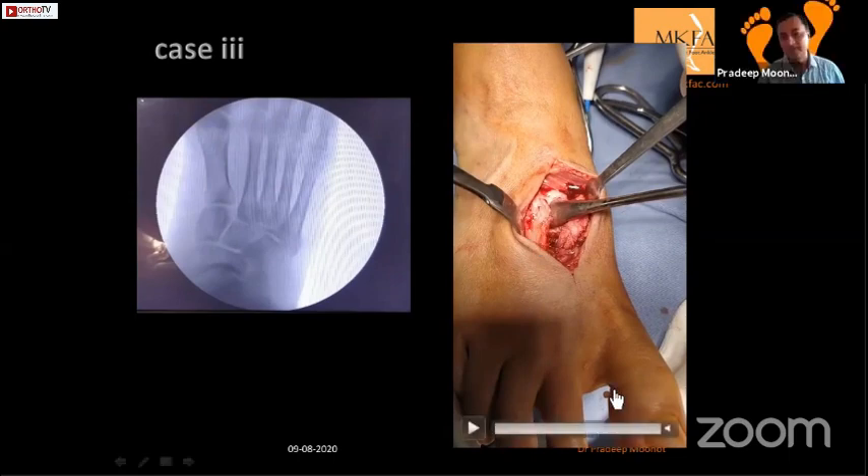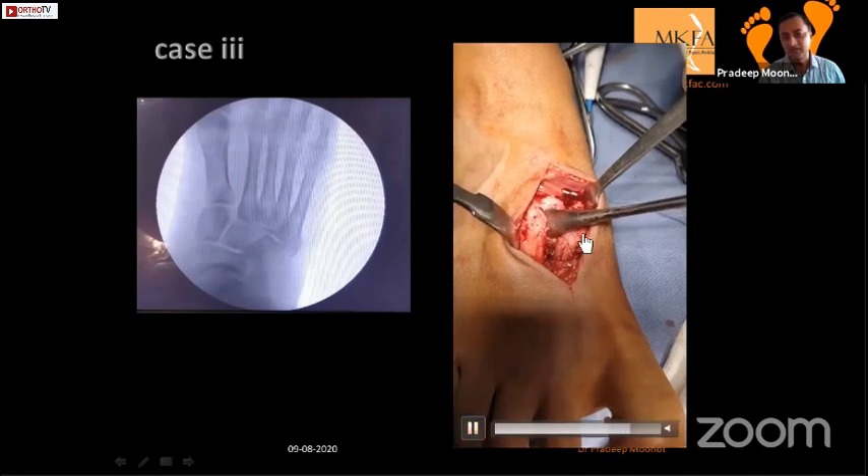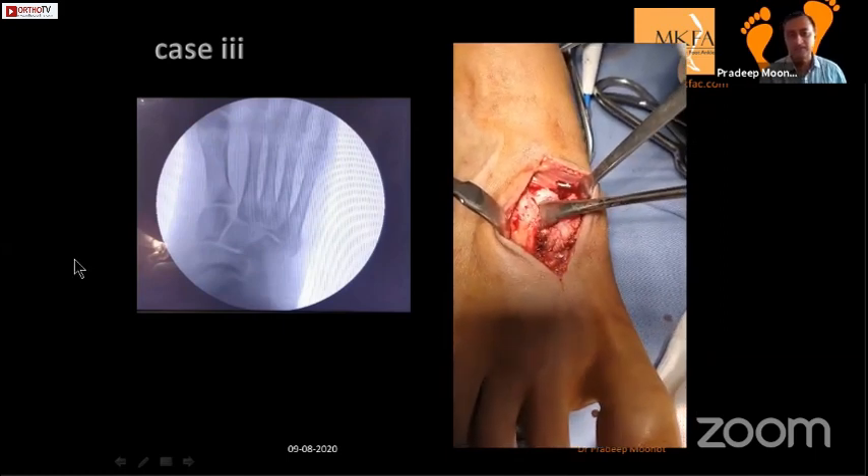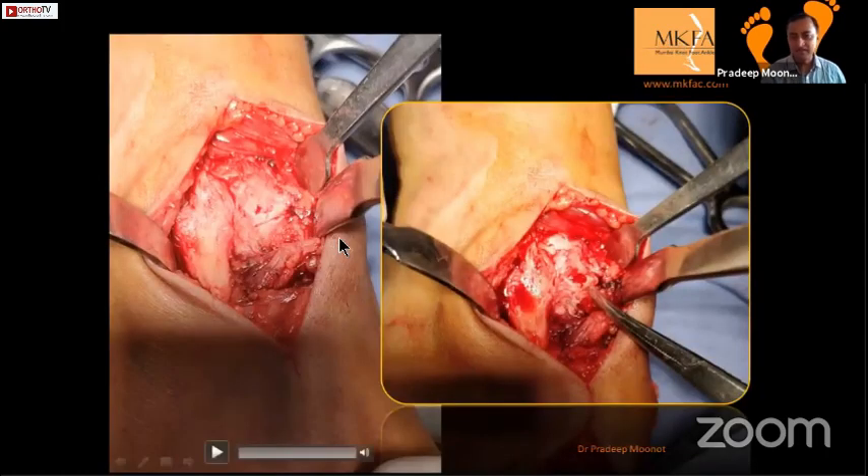The Lisfranc was unstable on the CT. Here you can see there is a step between the first TMT joint - the width of the forceps tip confirms the instability.